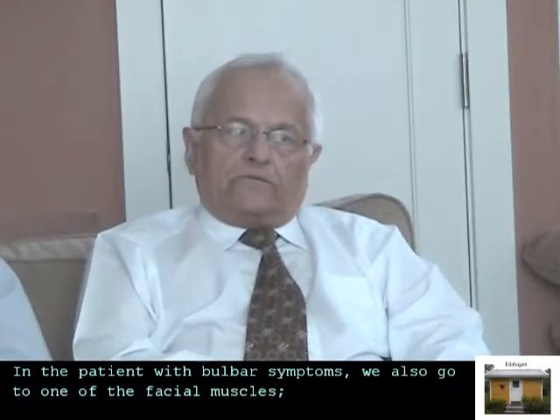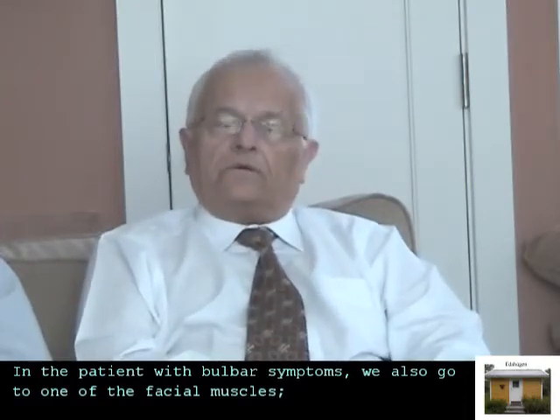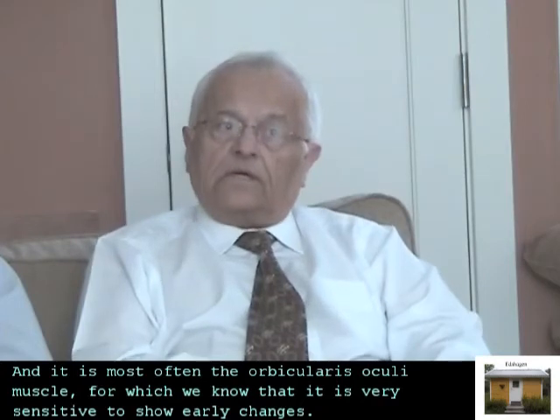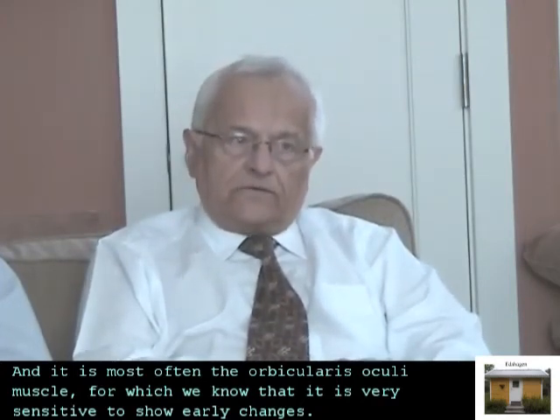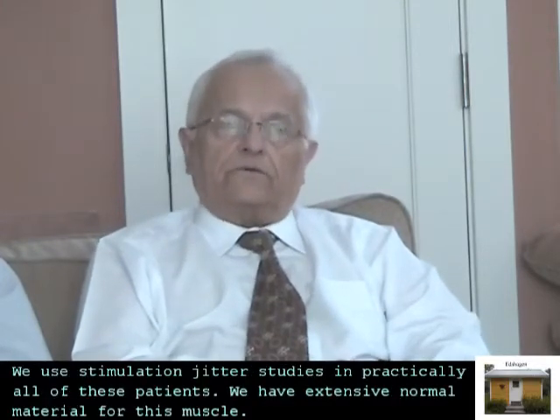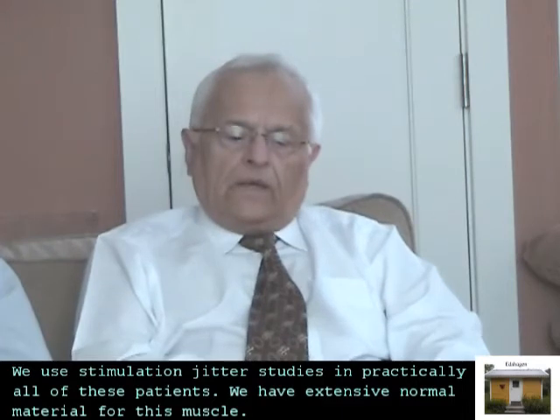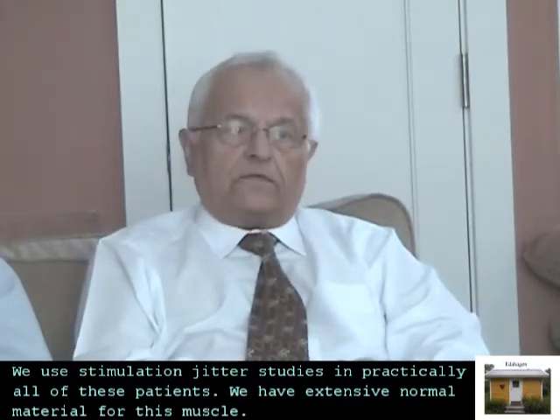In a patient with bulbar symptoms, we also go to one of the facial muscles, and it is most often the orbicularis oculi muscle, which we know is very sensitive to show early changes. We use stimulation jitter studies in practically all of these patients. And we have extensive normal material for this muscle.